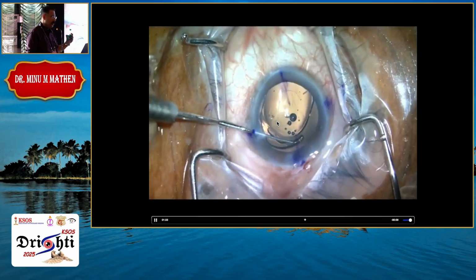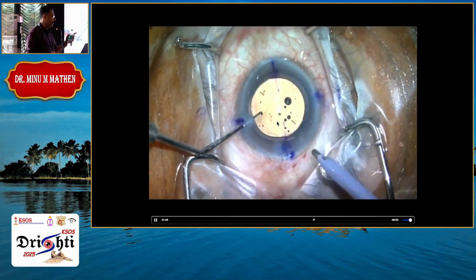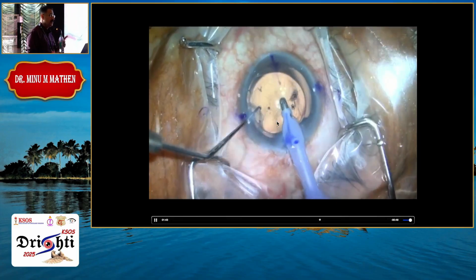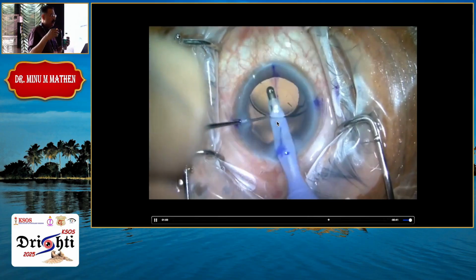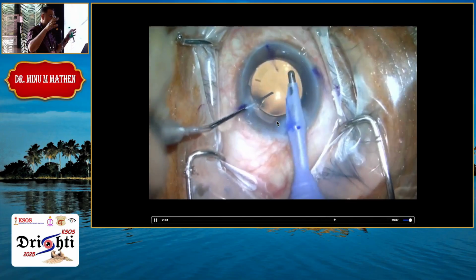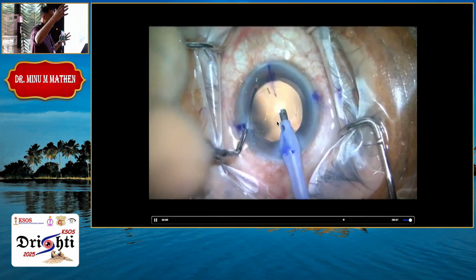So I use nowadays hydro implantation. That's very good, but still you have to wash. If you are folding the lens in visco, wash the lens again, even if it is hydro. But nowadays I am implanting especially Alcon lenses, I am folding it under BSS, so no visco inside the cartridge also. But still, always wash. It is important to wash the equator also, because it's the outer part of the haptic which is touching the equator, and that is where it has to stay.